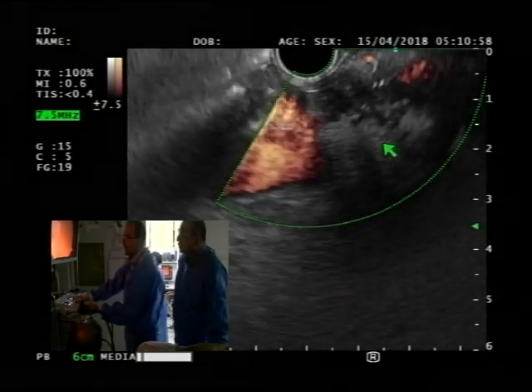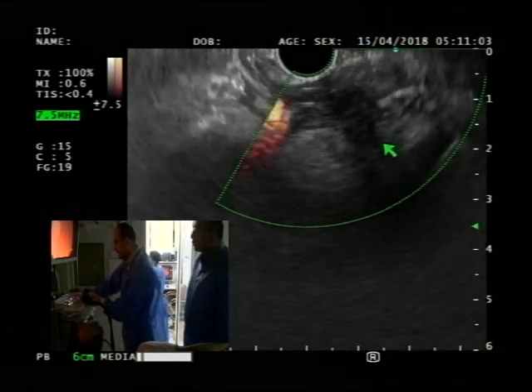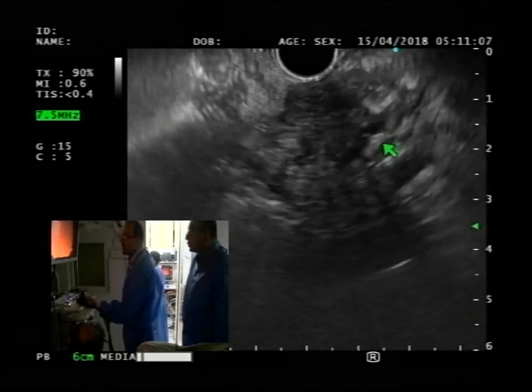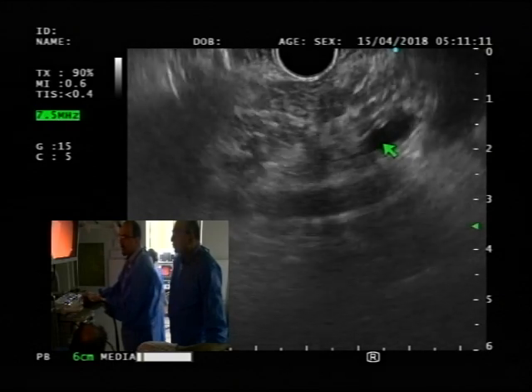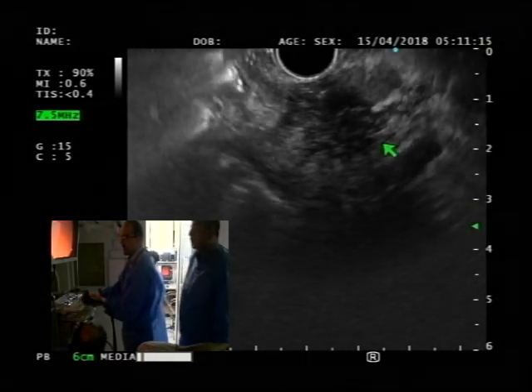So here. Once you get comfortable with these maneuvers, you can basically free one hand and do this single-handedly, like this. It's just figuring out what it takes to get into that position. Okay, so in the interest of time, I'm going to do the FNA, and then we'll have you take a look at this area too, okay?